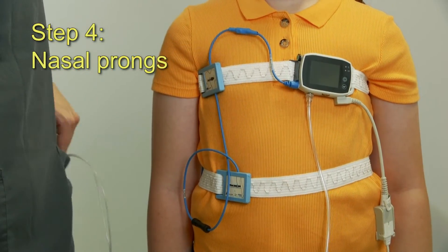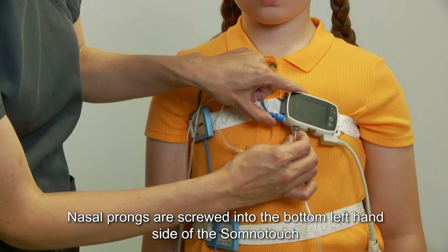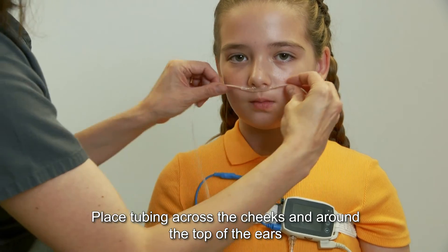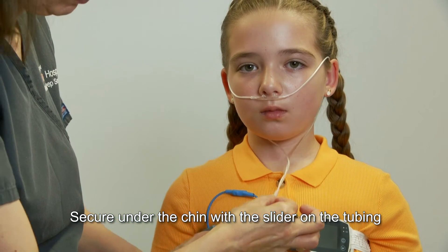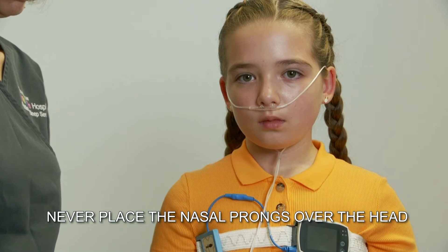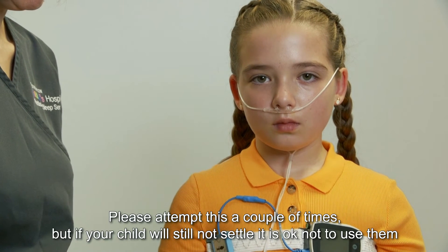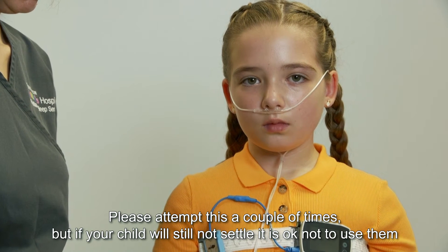Step 4: nasal prongs. Nasal prongs are screwed into the bottom left-hand side of the SomnoTouch. Position the prongs at the base of the nostril. Place tubing across the cheeks, around the top of the ears, and secure under the chin with a slider on the tubing. Never place the prongs over the head. If your child finds the prongs uncomfortable, you can remove them and try to reapply once your child is asleep. Please attempt this a couple of times, but if your child will still not settle, it is okay not to use them.